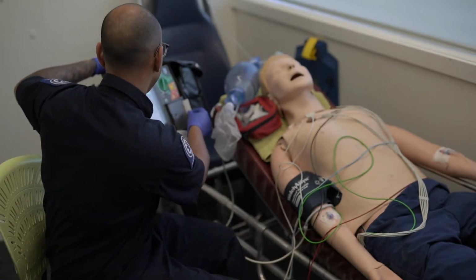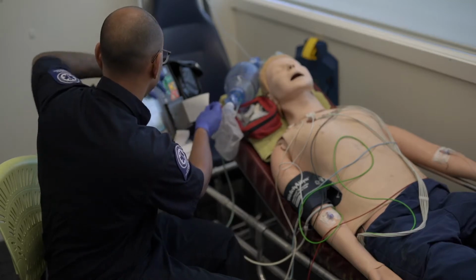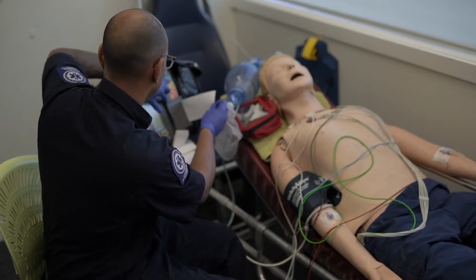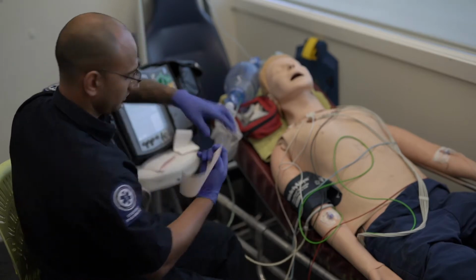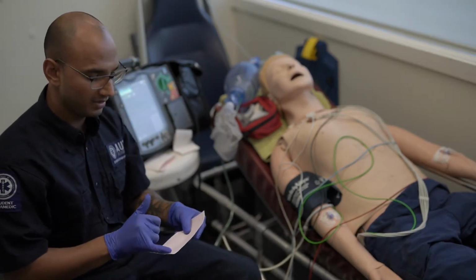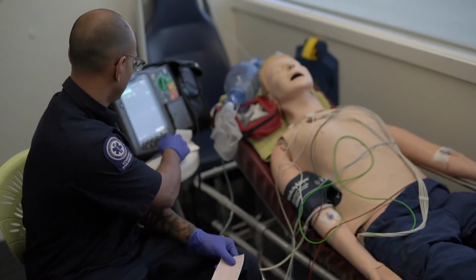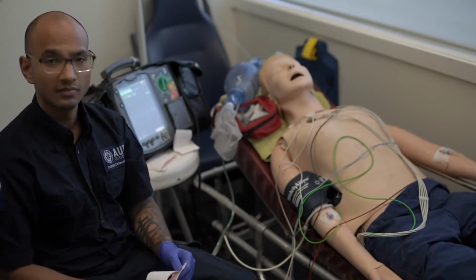I'll just print another strip out to confirm that. Yep, I can see a detection symbol above every QRS. Ensure the patient has received adequate sedation if indicated.